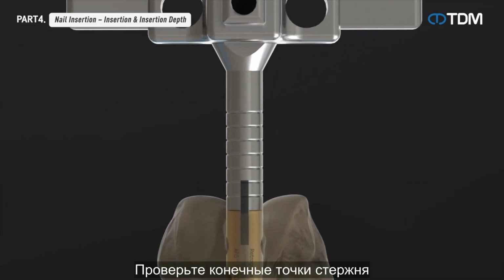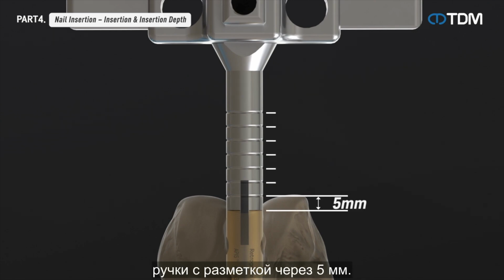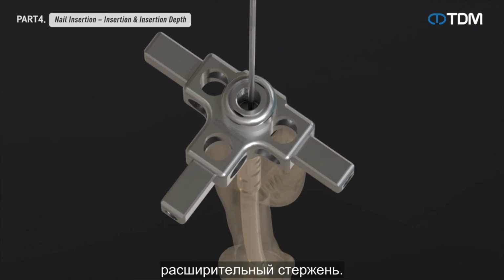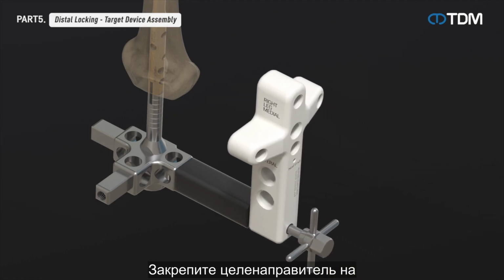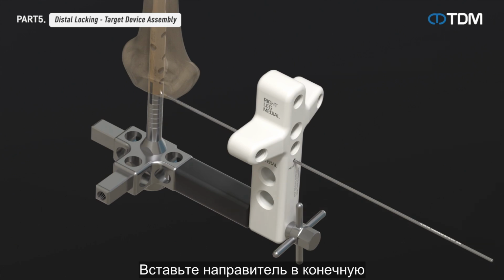Check the nail endpoints of the nail with the barrel gauge of the assemble handle marked 5 mm apart. When the insertion is complete, remove the reaming rod. Attach the target guide to the assembly handle combined with the nail. Insert the guide pin into the nail endpoint targeting. Align it with the end of the nail and check the depth.